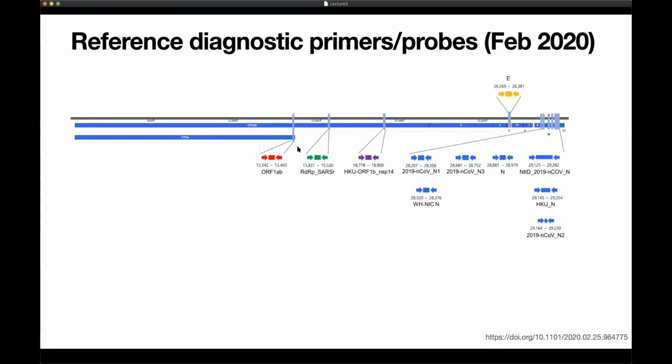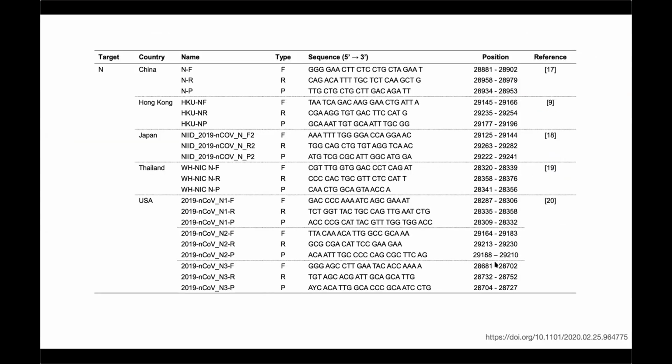So for instance, one of the reasons this probe is here is, if you remember the slippage site, which is unique to SARS coronaviruses, that's the area of the slippage site, which has very, very strongly conserved secondary RNA structure and other constraints. But potentially because of that, it could also be a poor probe because of the old secondary structure. Right? So with that out of the way, let's see what they've actually evaluated.